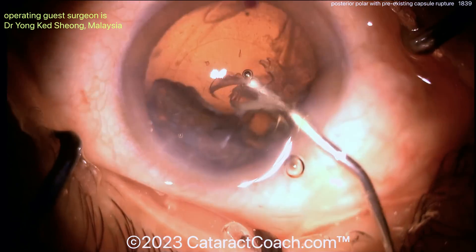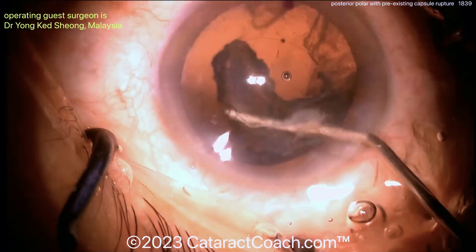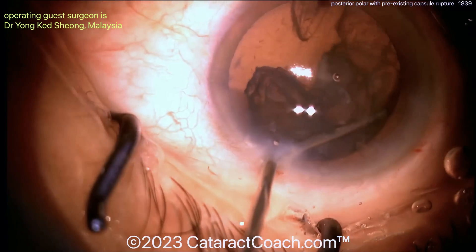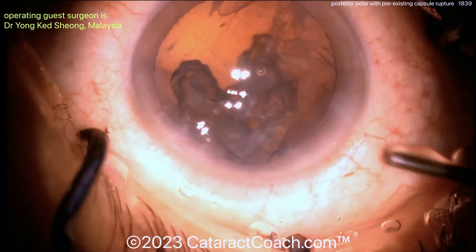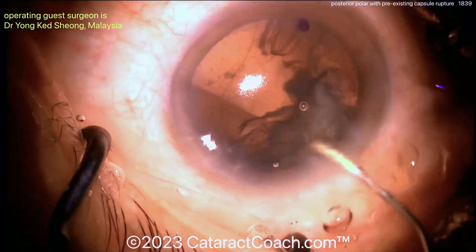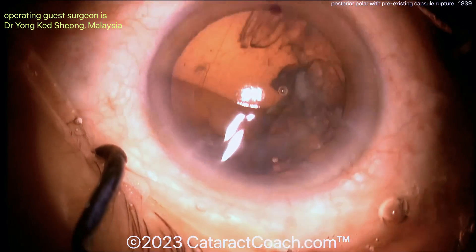Look at that beautiful visco-dissection in all quadrants — very nice. That separates the epinuclear shell but also even separates the cortex from the capsular bag. I want to save that capsular bag. Beautifully done here. And then again, more visco-dissection — no hydrodissection — getting those pieces up.